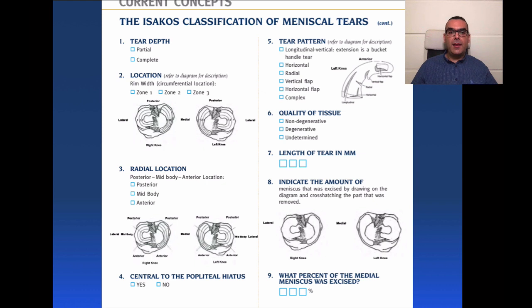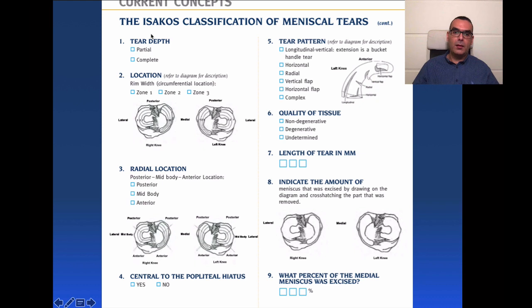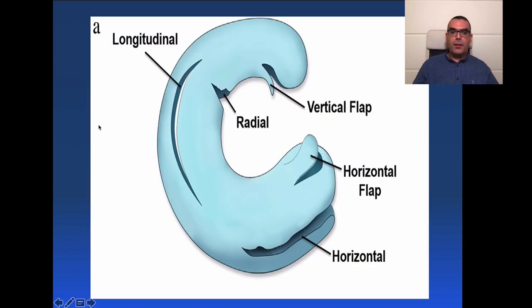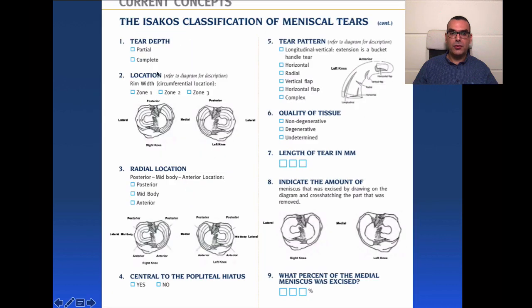When you describe a meniscal tear, it is not enough to simply state 'horizontal tear at the posterior medial meniscus.' You must describe very important variations. First, comment on tear depth: is it a partial depth tear or a complete thickness tear? For vertical tears, is it interrupting one surface — superior or inferior — or coursing from superior to inferior surface? That is the tear depth, applicable for vertical tears.